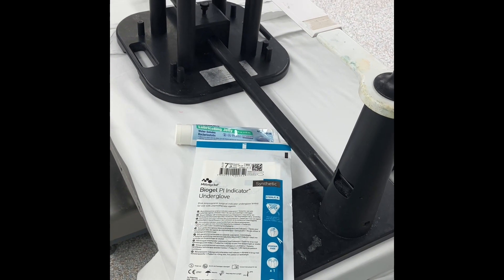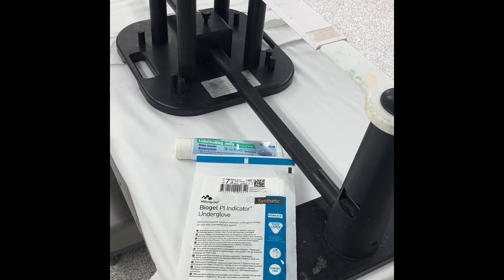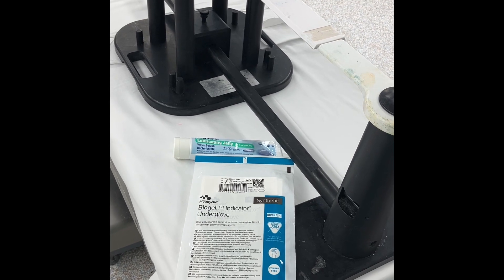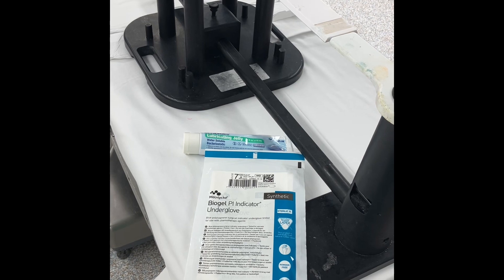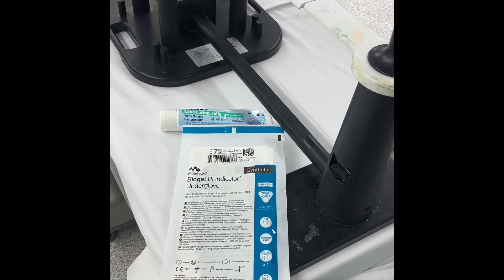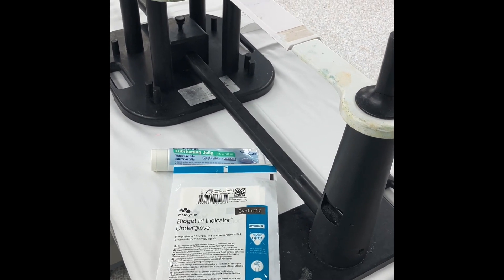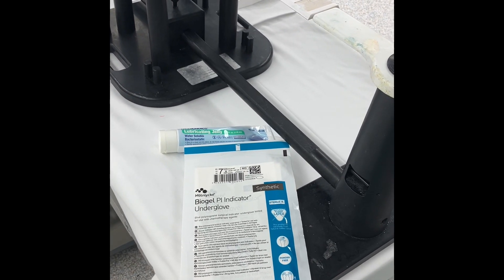This is considered to be an unsterile case, but I have found that if you use regular exam gloves, the casting material is so sticky that it's kind of a huge pain to try to hold the leg with. So I actually open a pair of sterile gloves that fit me appropriately, and it just makes holding the leg a little bit easier. It's still going to be sticky and tacky, but it's just a little bit easier to hold with a glove that fits my hand.